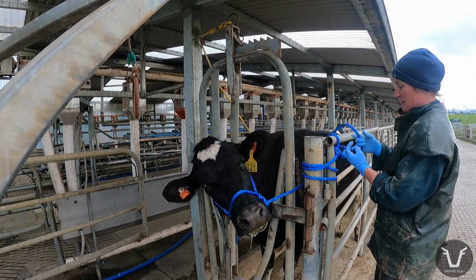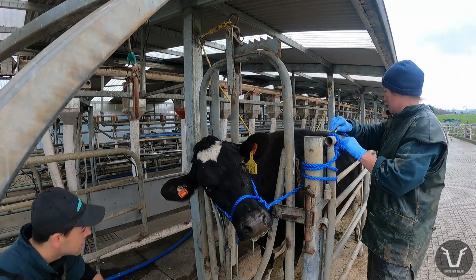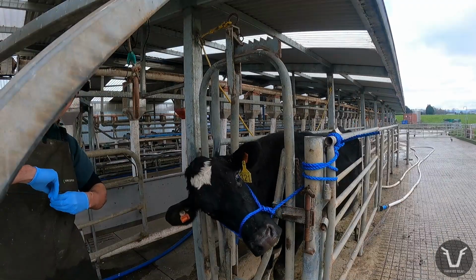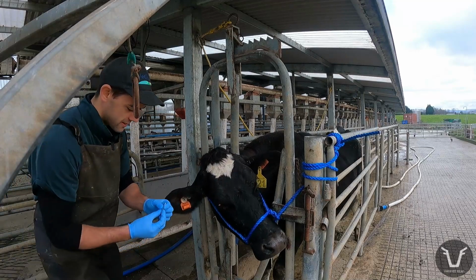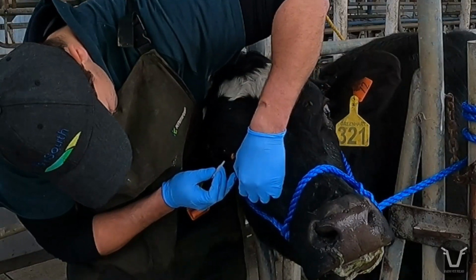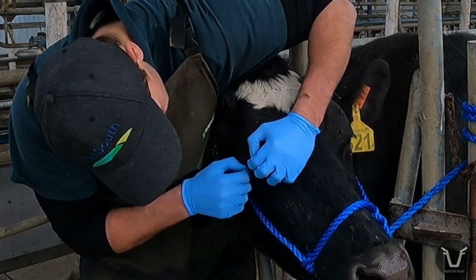The good news for this cow is that for now at least, the cancer appears to be limited to her third eyelid. If it had started elsewhere or spread further, then the only reasonable treatment would be to remove the entire eye. Now cows cope remarkably well with one eye, but if we can avoid removing it, even better. It's a quicker and less distressing procedure with a much more rapid healing time, and she keeps her sight intact.